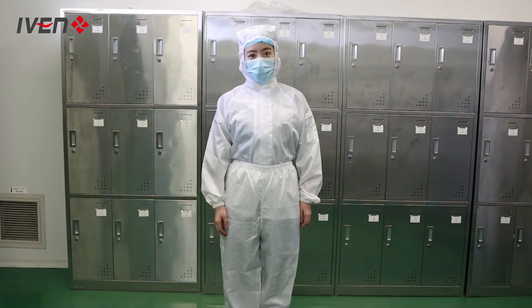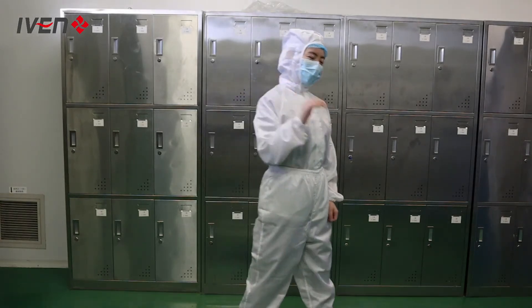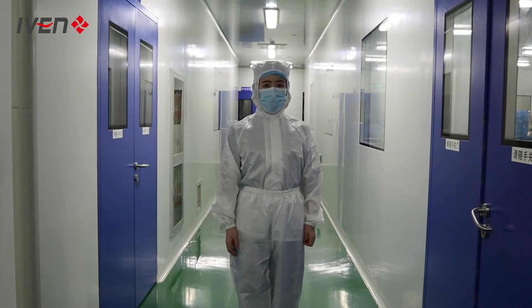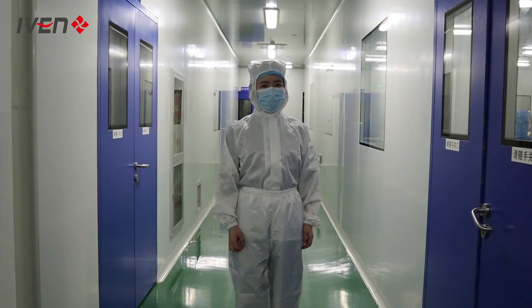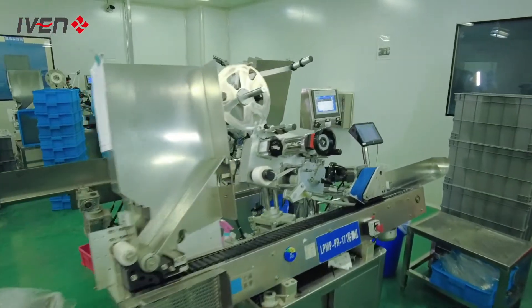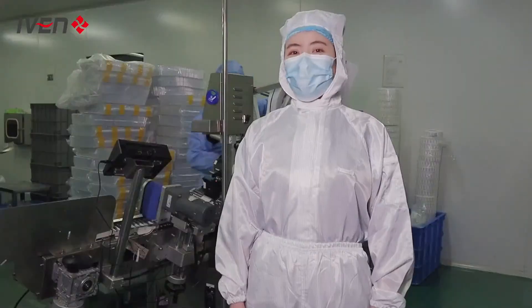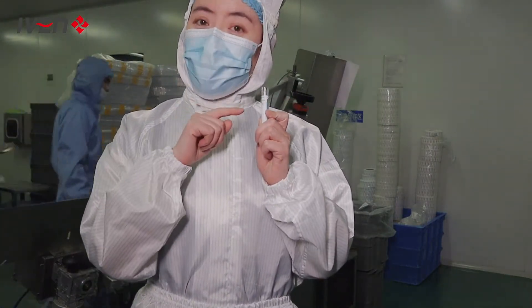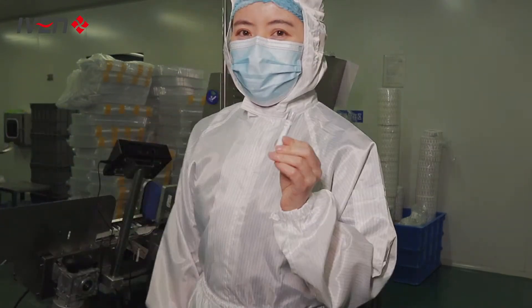Now we are in the second change room. For entering into the clean room, we have to change our clothes and wear masks. Let's go. Now we are in the clean room. We will go inside different workshops to see how a tube is produced. This room is for labeling. At the beginning, the tube is without any label, and now, after this machine, the label will be pasted on.